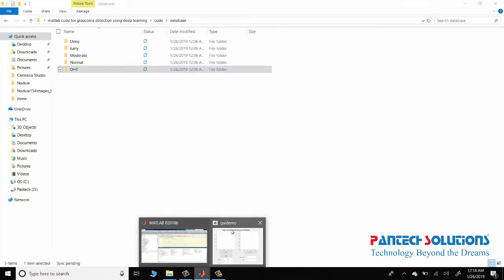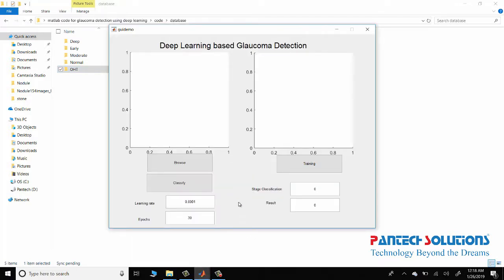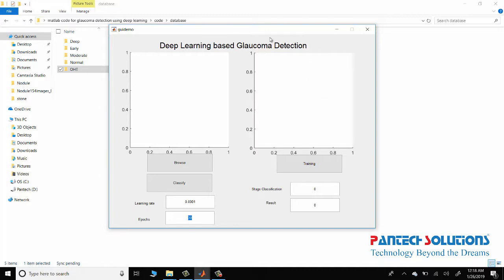So the first process is training. You can change the learning rate here and the approach here. This approach uses CNN — Convolutional Neural Networks.